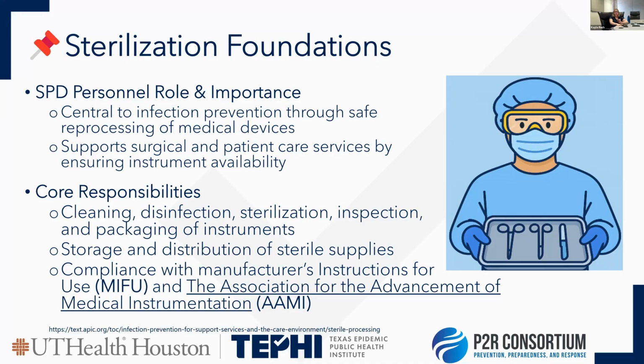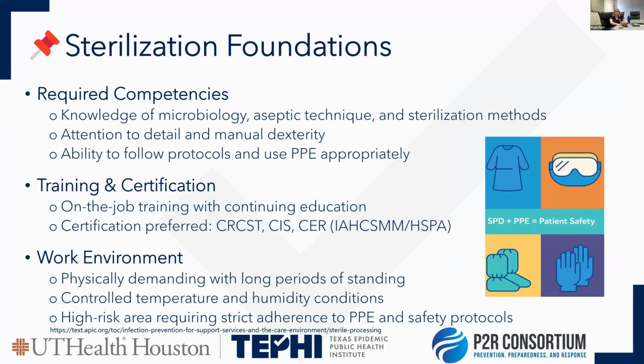And their goals are that they have huge compliance with the manufacturer's instructions for use, or the MIFUs, as I've mentioned, and also the Association for the Advancement of Medical Instrumentation, known as AAMI. They are the ones that put the standards of what the equipment should be run at, the pressure, temperature, air exchange in these areas, along with a couple other organizations as well, to make sure that this equipment is maintained and sterilized appropriately, to make sure that we're providing great care to our patients and not increasing harm.